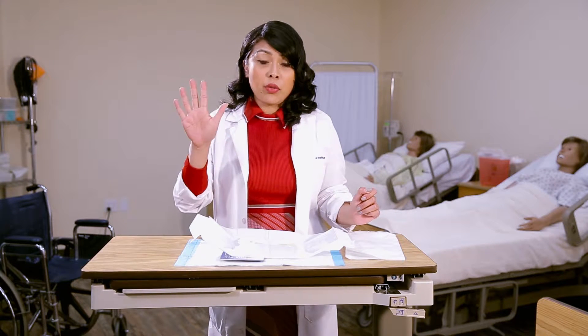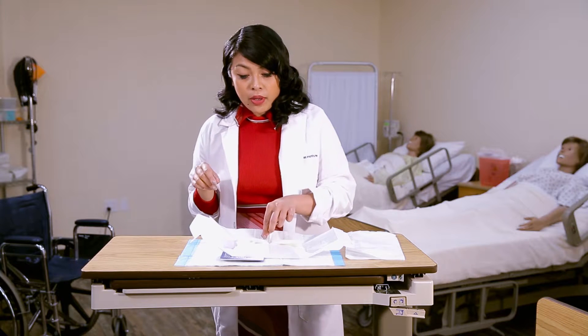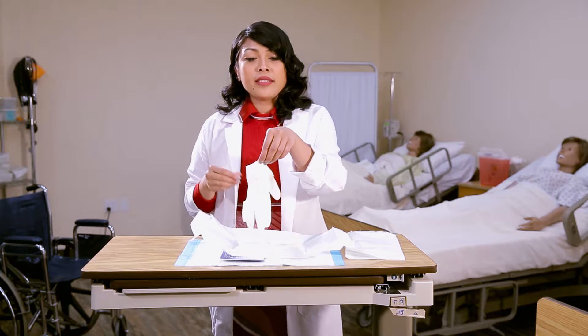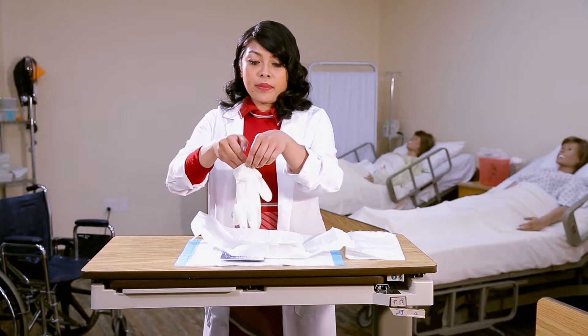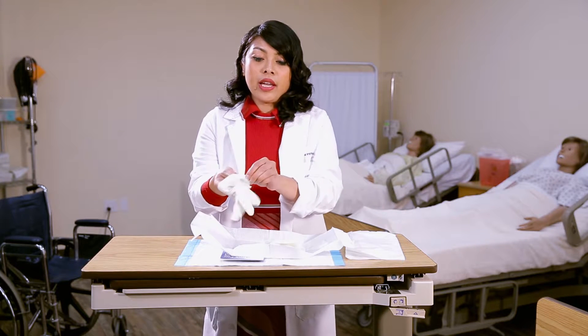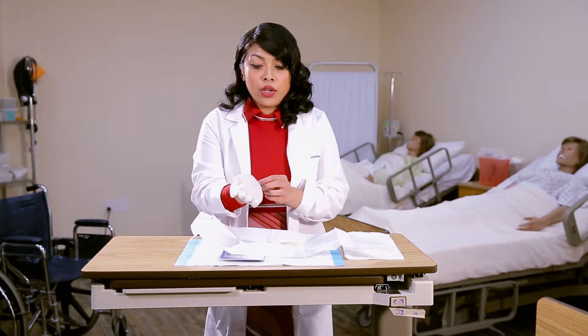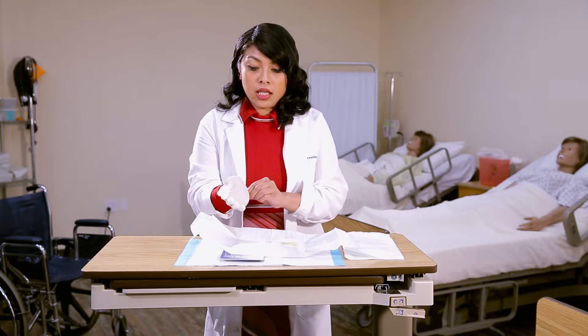You want to start from the dominant hand — I am right-hand dominant. With my left hand, I'll hold the glove from the inner cuff; that's the area you can contaminate. Insert and pull towards yourself. If it feels uncomfortable, you can fix it by pulling towards you and making sure the thumb is anchored.